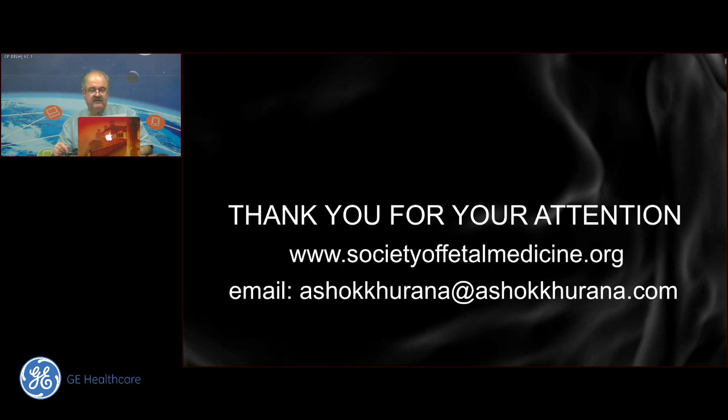Then we have to differentiate between multicystic kidneys and polycystic kidney disease. Polycystic kidney usually has echogenic small cysts that you can't see as individual cysts. Multicystic is larger cysts, the vast majority of them more than 2 to 4 millimeters, and sometimes up to 12 and 14 and 16 and 25 millimeters. And then of course, typically the polycystic kidney disease is bilateral diffuse large kidneys. The multicystic is either one whole kidney or part of a kidney, rarely both kidneys, but again very large. Sometimes it is a little tricky to differentiate between gross hydronephrosis and a multicystic kidney. You rock your transducer, you move it around, and you will often define this. And what I always do is a 3D sweep, and I do a sono AVC. It just lights up my kidneys, and I get the answer on 3D.